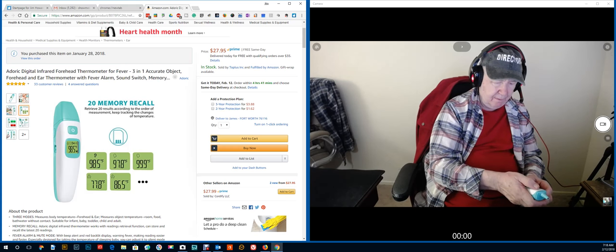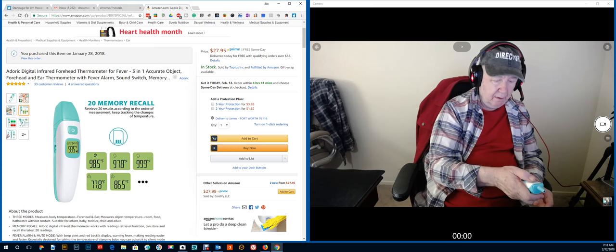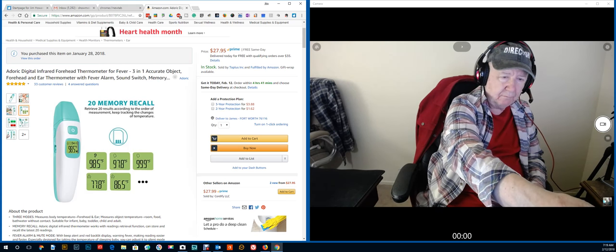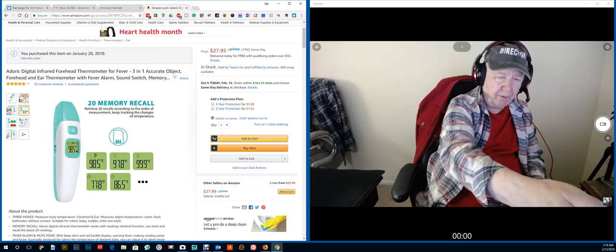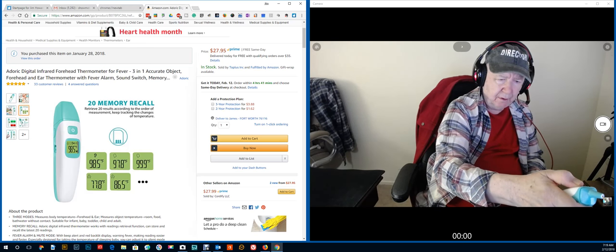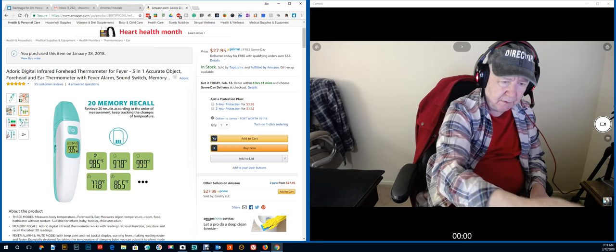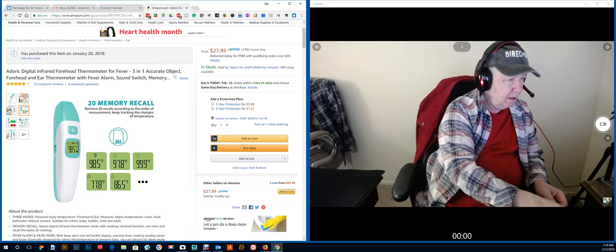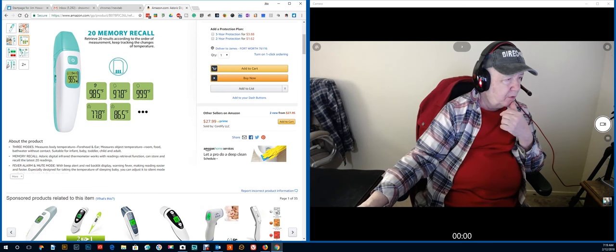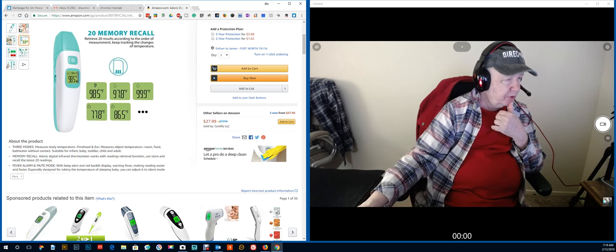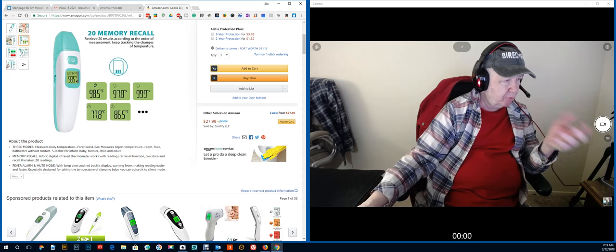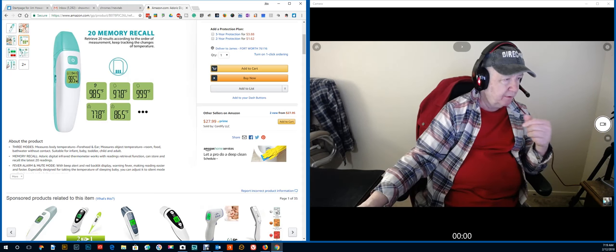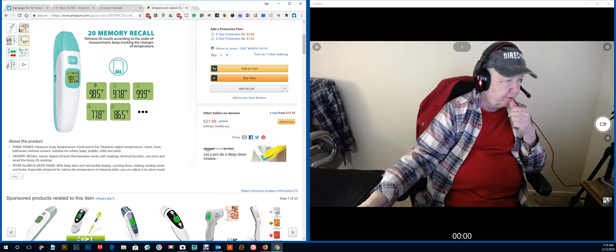So, there we go. Still on the forehead? Yeah, still on the forehead. Let's see. So, three modes. Measure body temperature by using the forehead or the ear. Measure other objects, room, food, bath, water, without contact. Suitable for infants, babies, toddlers, child, and adult.